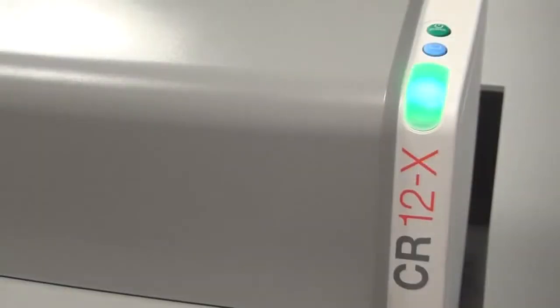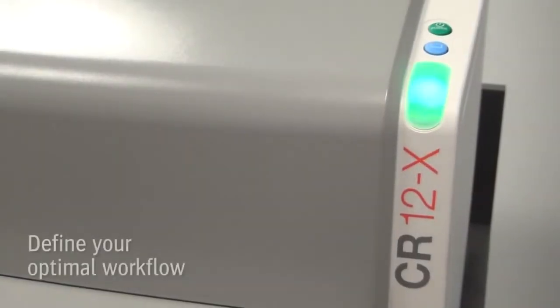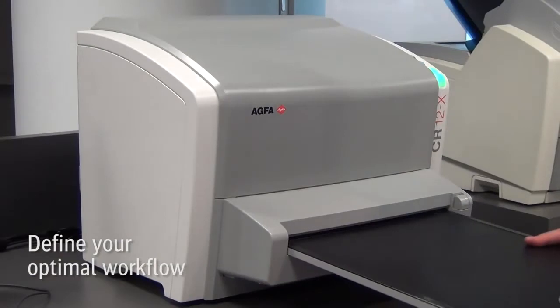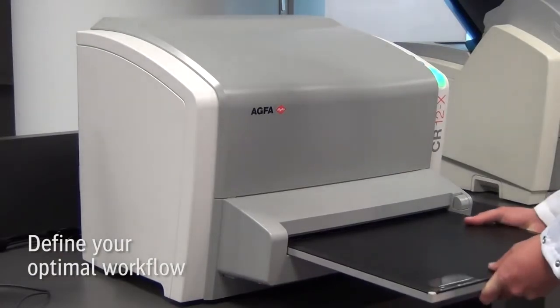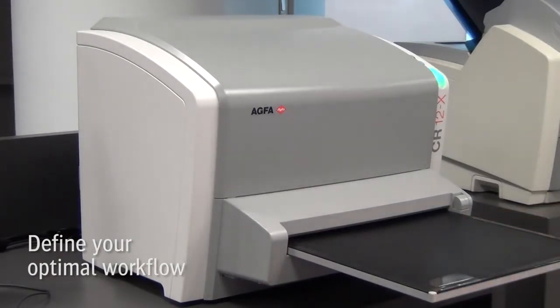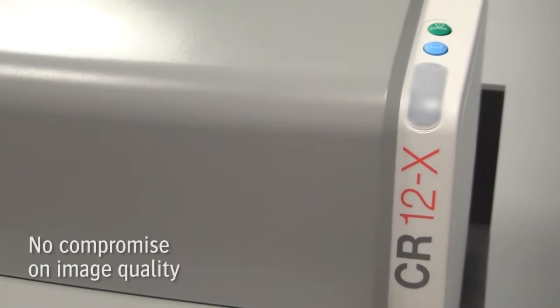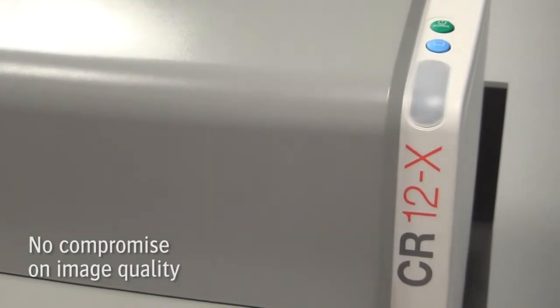CR12X enables you to choose your optimal workflow, and in addition, for each examination, you can easily select another preferred resolution.